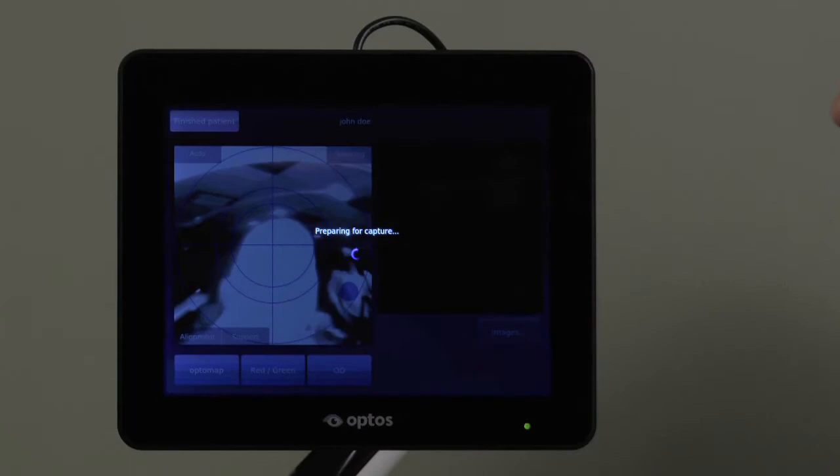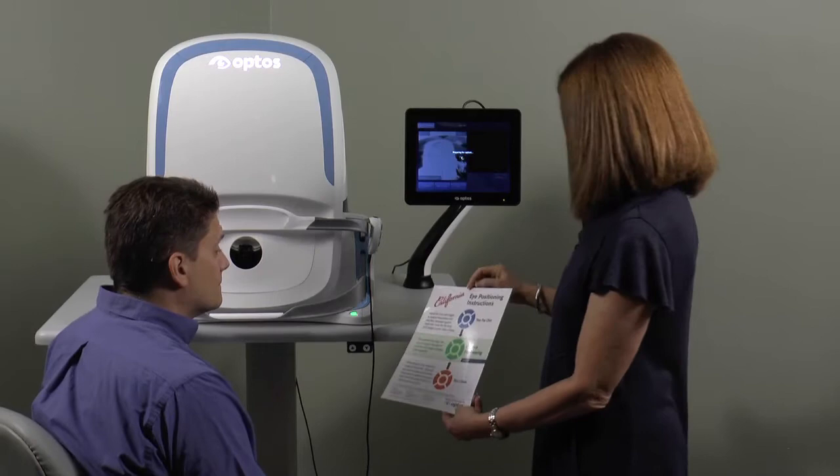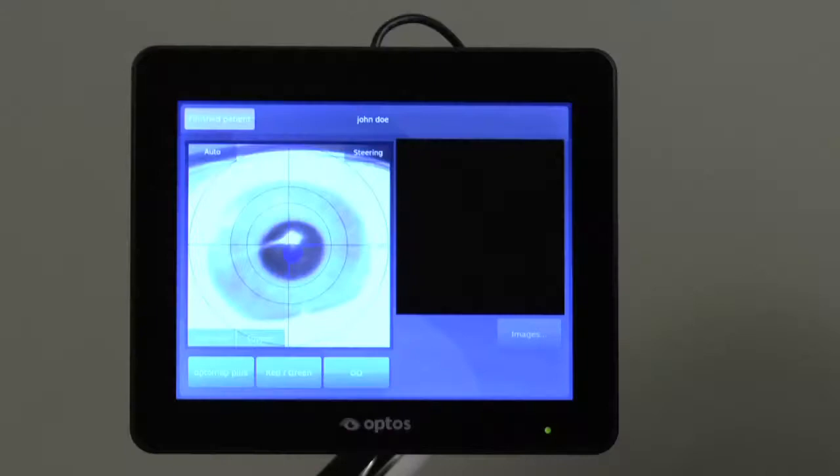Using the laminated sheet provided, explain to the patient that they will need to look straight ahead and align their eye with the fixation target, which will be blue at first, then change to green as they move closer into the correct position.